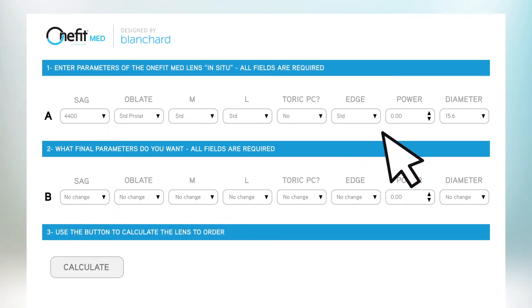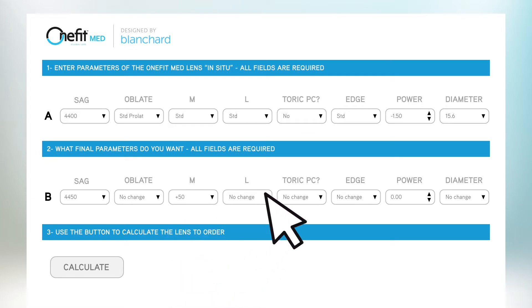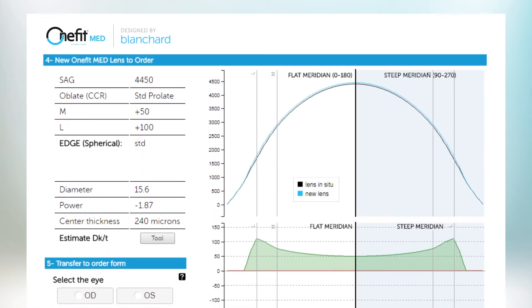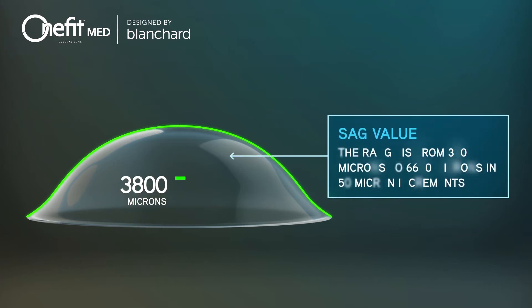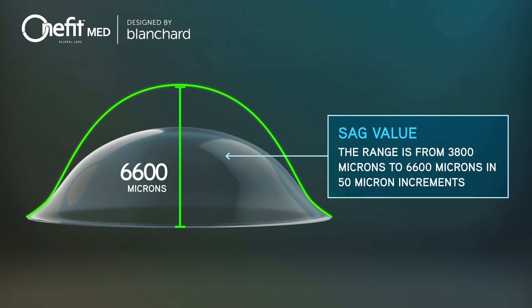The easy-to-use online fitting tool helps you calculate the final lens parameters and gives you a graphical representation of the new lens you designed. The sag value determines the general vaulting characteristics from center to limbus, with a range from 3800 microns to 6600 microns in 50 micron increments.